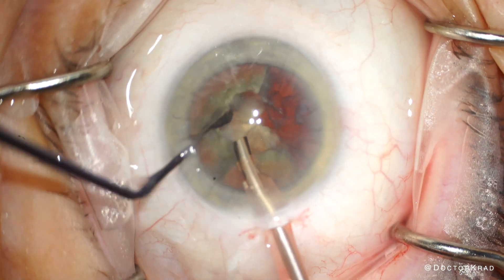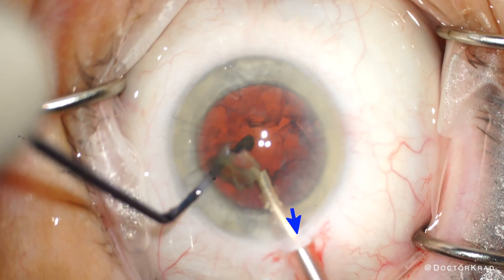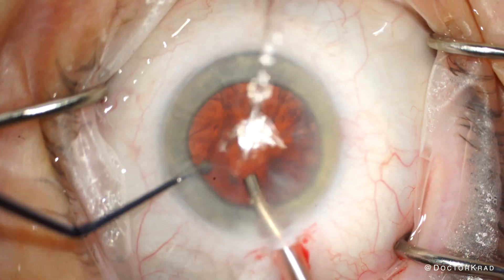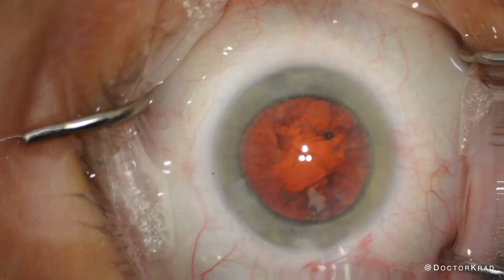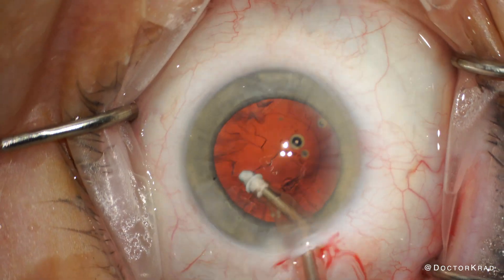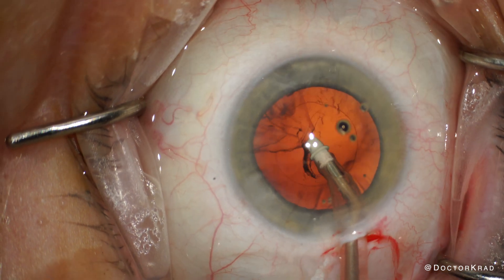Here we're going to complete removing the cataract. During the procedure, you can see this white lip of sclera right between the corneal limbus and my incision. This is protecting the RK cut — it's preventing my main incision from radializing into the RK cut. But make sure this scleral lip is thick, and you're not making your tunnel too superficial.